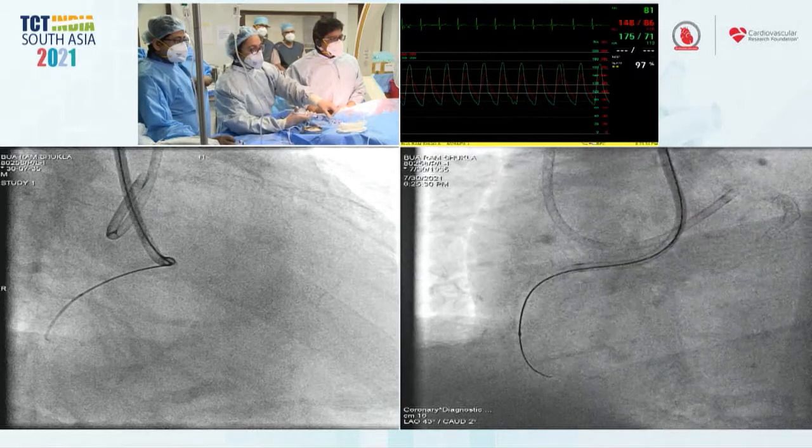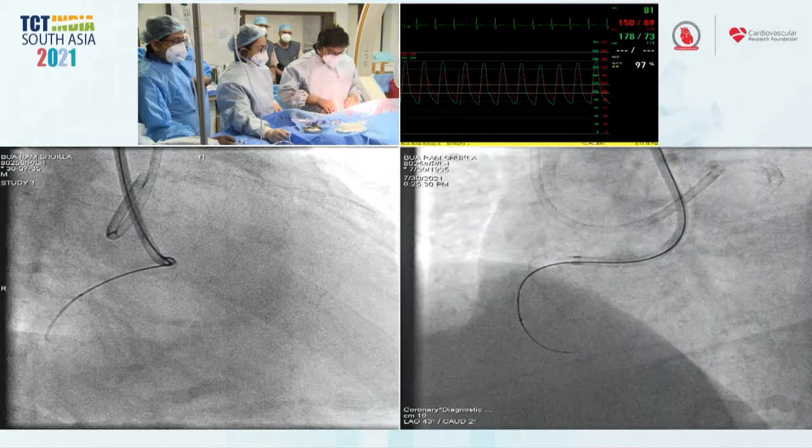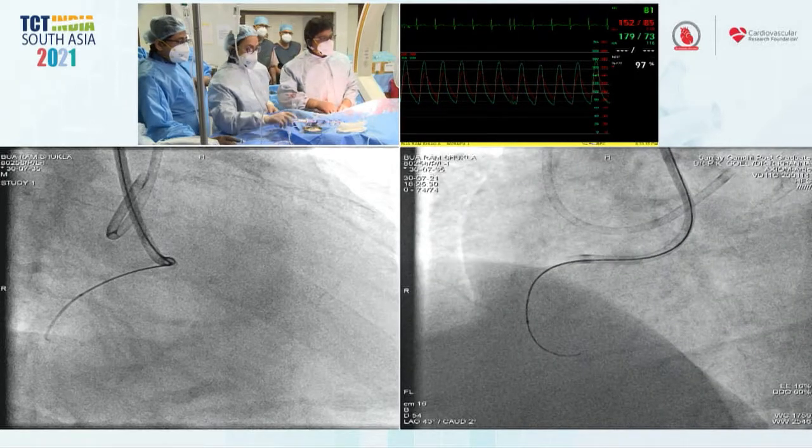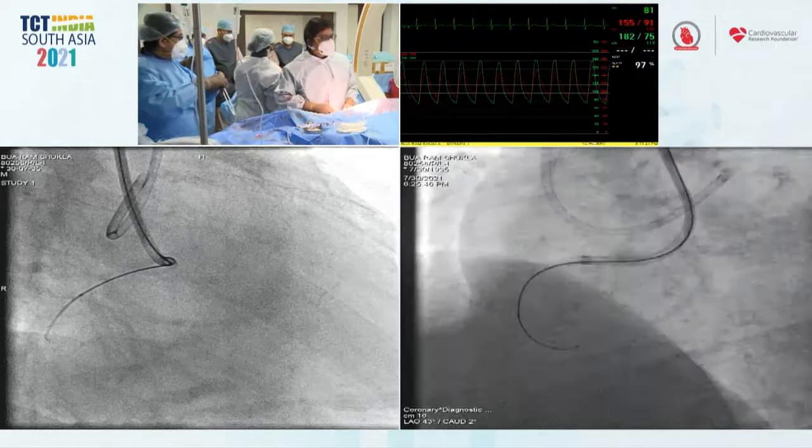It sounds like we're going to move to another live case and come back. Yeah. We'll be looking forward to your progress when we get back in a few minutes. Okay. Give me a trapping balloon.